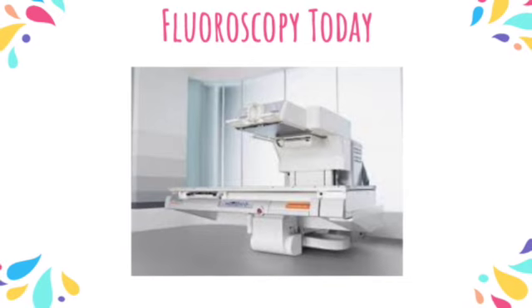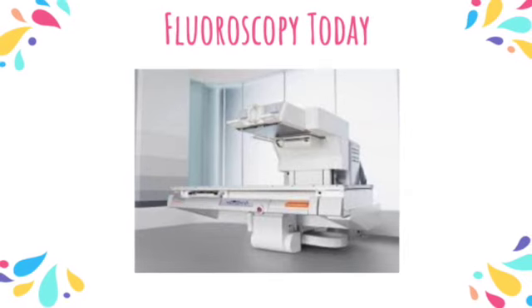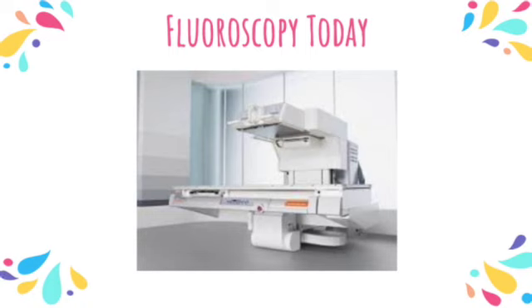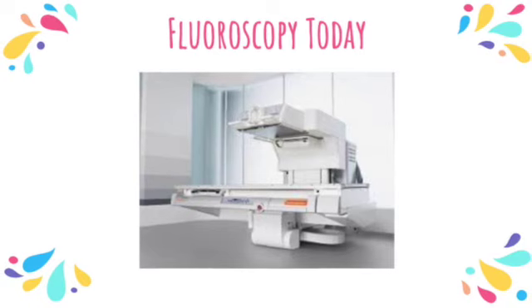There is a video camera, which converts light to video signal. The video signal travels through an ADC, or an analog to digital converter, which converts video signals to digital signals. This allows images to be stored and processed on the computer monitor. Modern fluoroscopy is typically used in pulse mode rather than the previous continuous mode, where the beam is pulsed and decreases exposure to the patient and technologist.